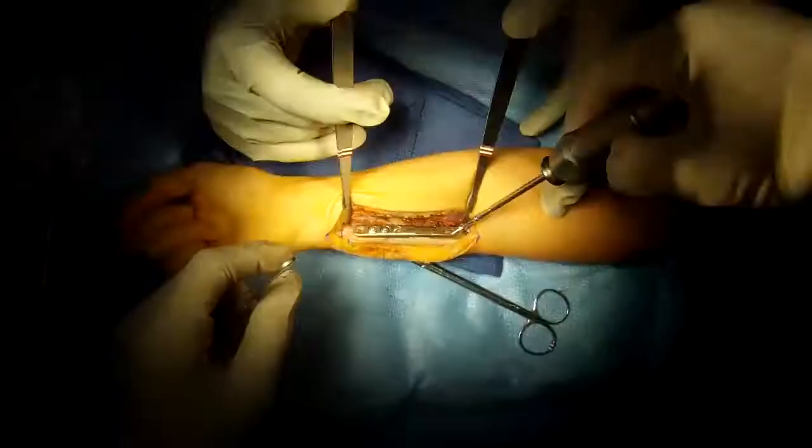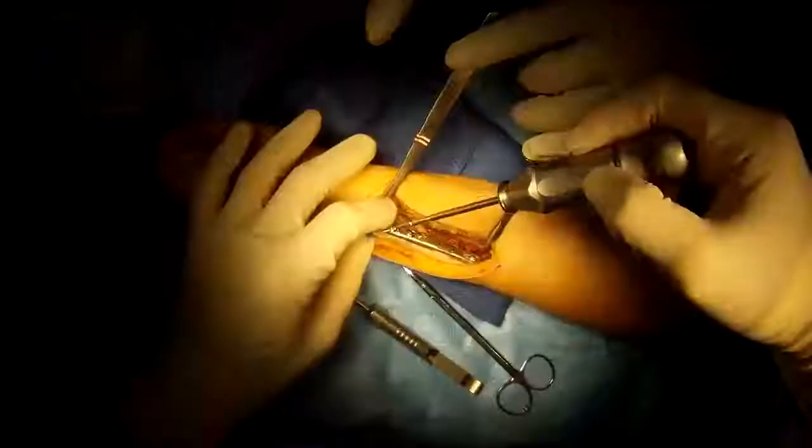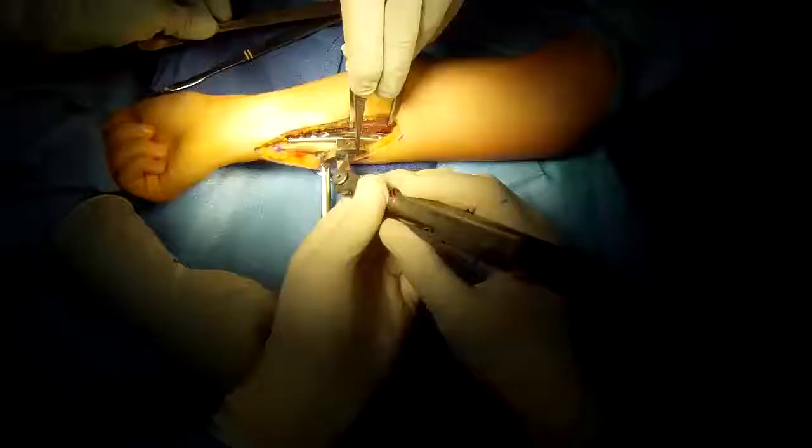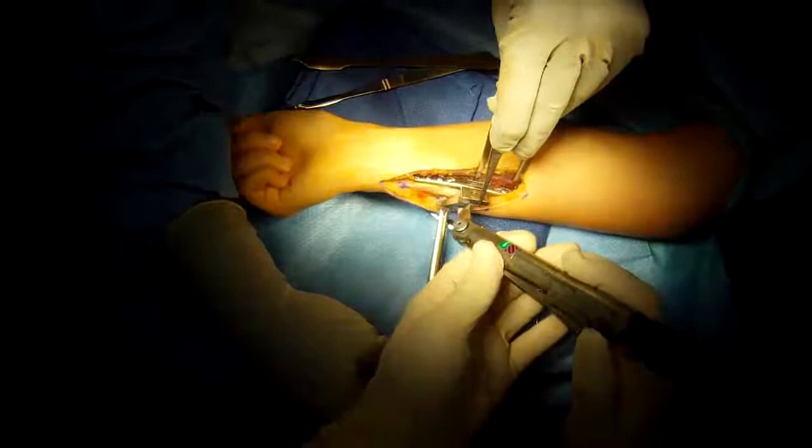Placing a screw through a slotted hole on the other side of the plate that will fix it, but also allow the plate to slide on the bone so we can close the osteotomy after we take out a certain number of millimeters of length.